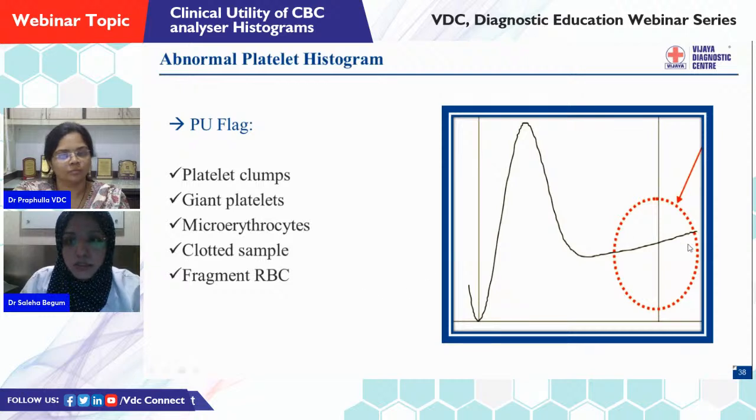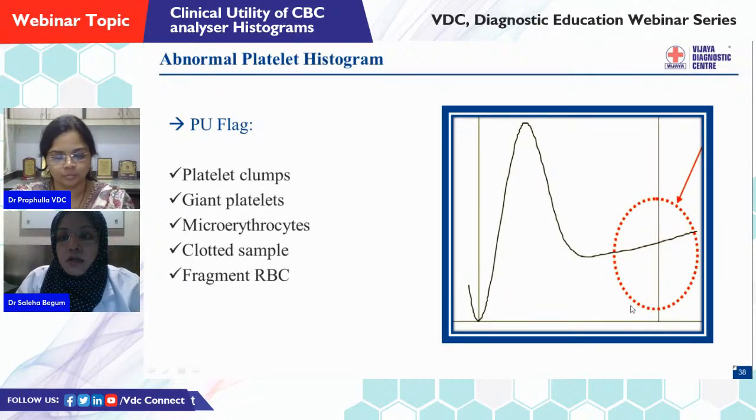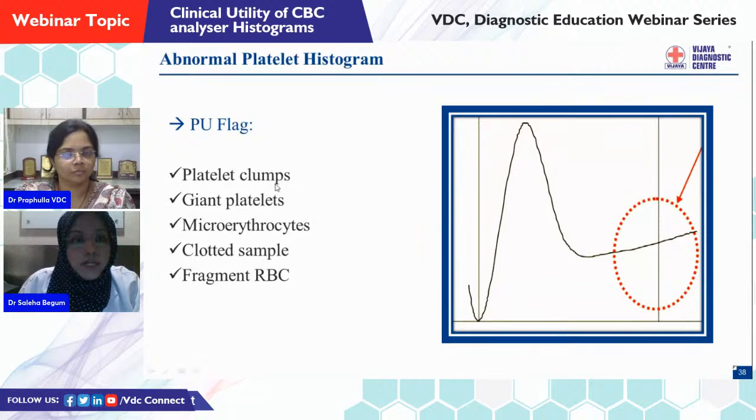Coming to this type of abnormality, the graph is not ending at the baseline. Again, the causes are, as I said, the upper discriminator is not able to judge whether they are platelets or something larger than the platelets. So it gives an abrupt ending to the graph. The causes for such a graph are platelet clumps, giant platelets, microerythrocytes, clotted sample, or fragmented RBCs. Fragmented RBCs will be much smaller than the routine normal RBCs. That's how they got counted in the platelet chamber. And clotted blood and giant platelets may reach the size of an RBC. Again, they get a place in between an RBC graph and a platelet graph. So that's how you are getting this abnormality in the graph.